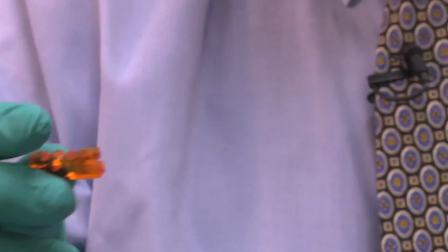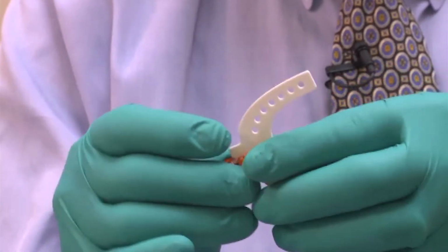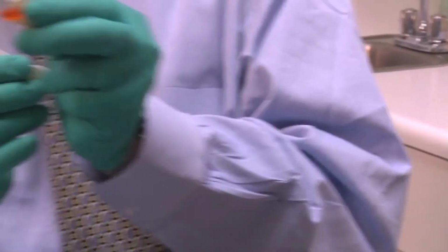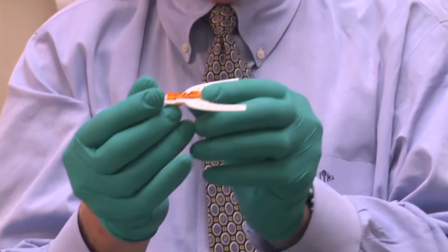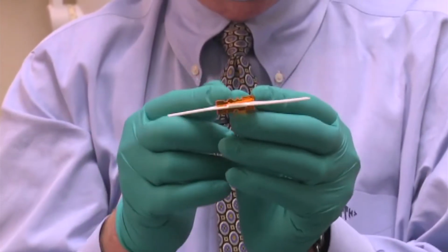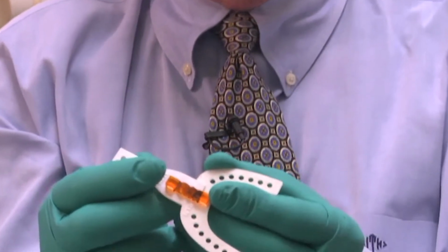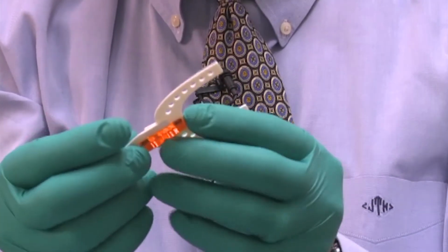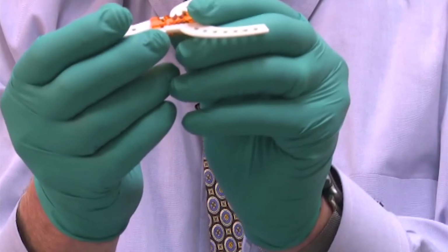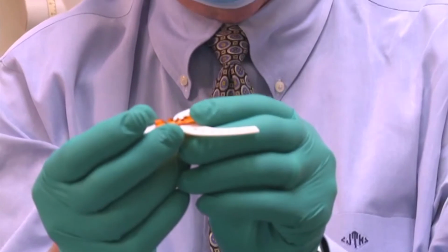We'll take the bite fork, position it on our key, and we will take the handle and put it on the other end of the key. Now in this situation, it doesn't matter what number faces her throat, because we're using the edge to edge position. If there was more of a horizontal component, it would be critical for you to pay attention how you position the handle and the bite fork on the key to ensure that you're in the proper position.